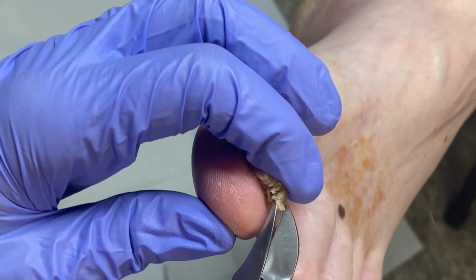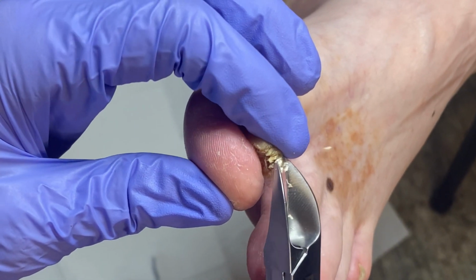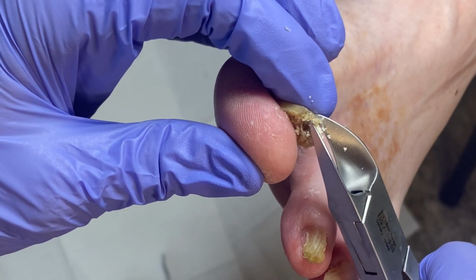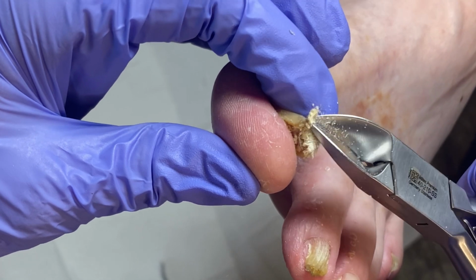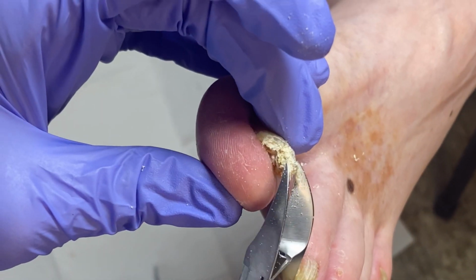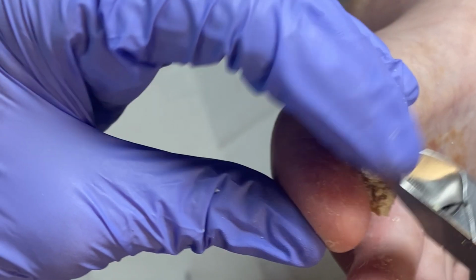You want little tiny nips, and they grow in layers. The top layer is the hardest layer. You can soak it first, which would help. So you just go little tiny clips across. Try to get the top layer first. Across, just little tiny nips.